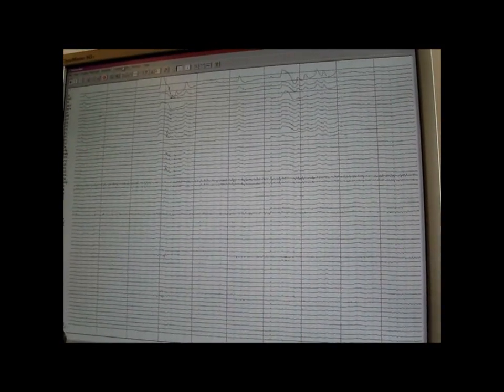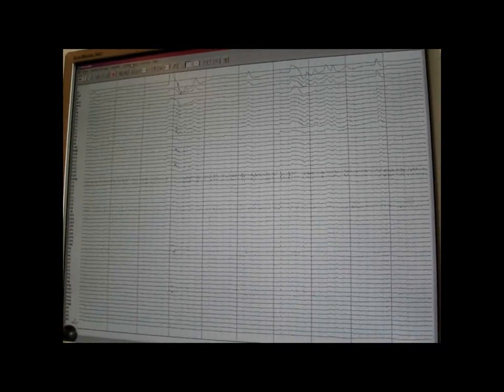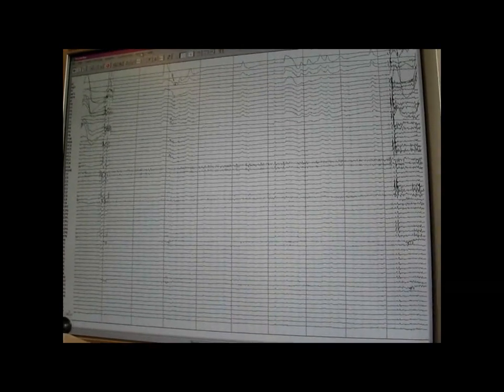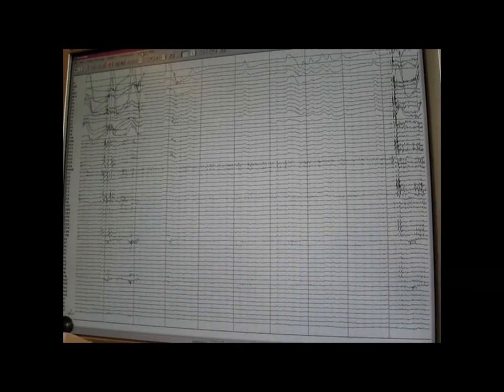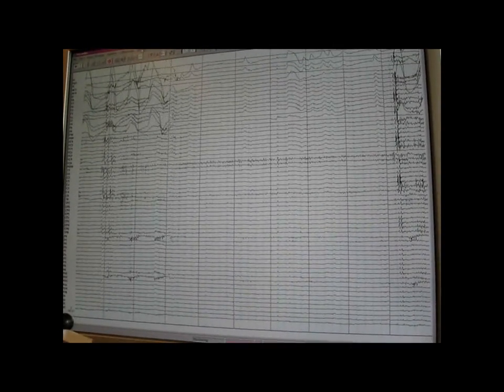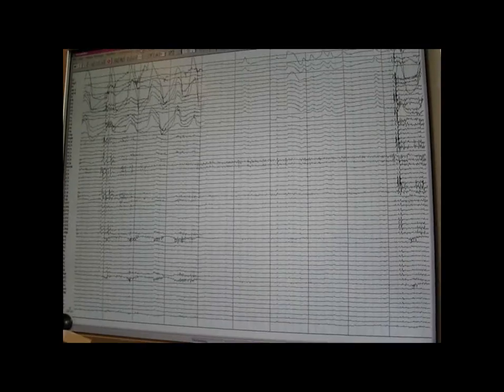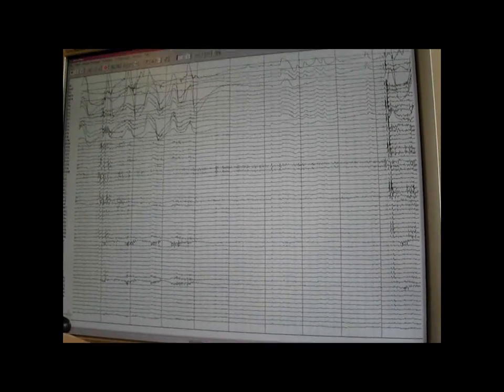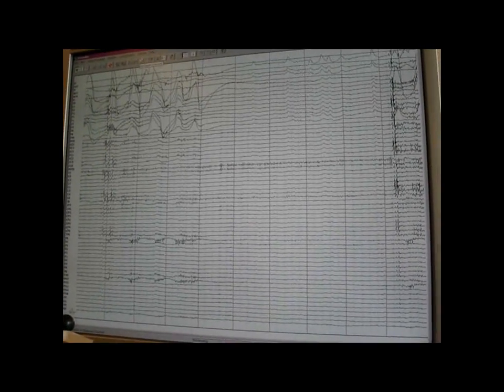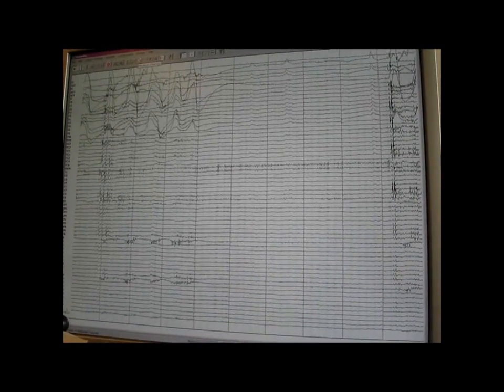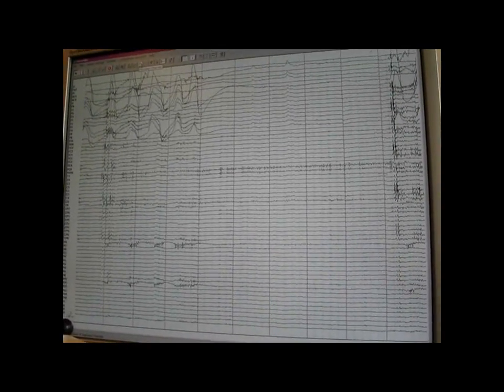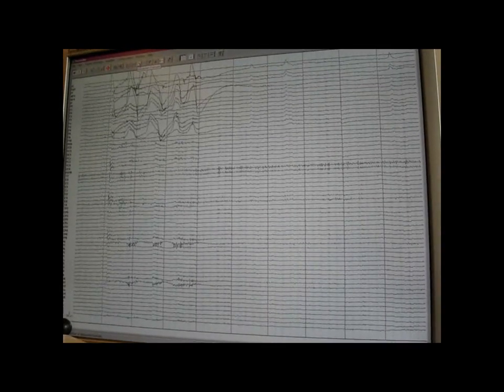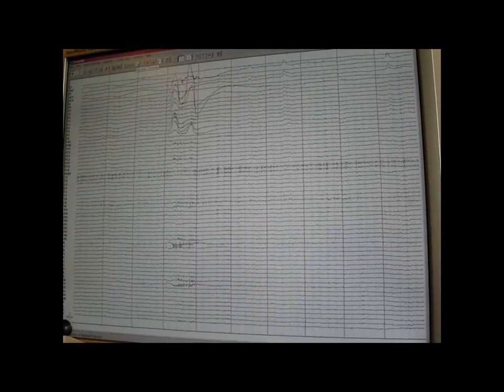What you can see there is interference from blinking. That's what just blinking does and moving my eyes a lot, and you can see how that is interfering with the actual EEG readings as the muscle activity produces much greater electric signals than the actual brain waves.